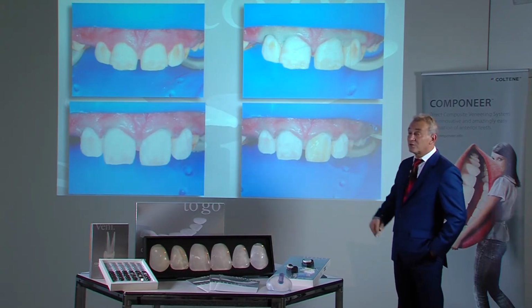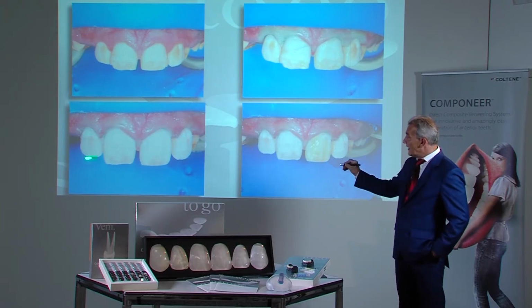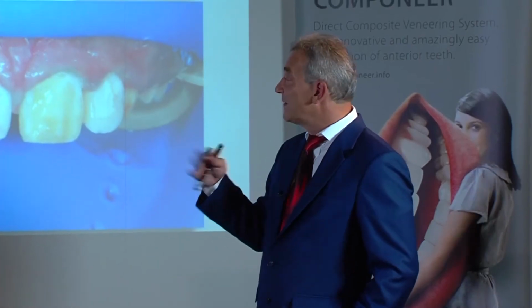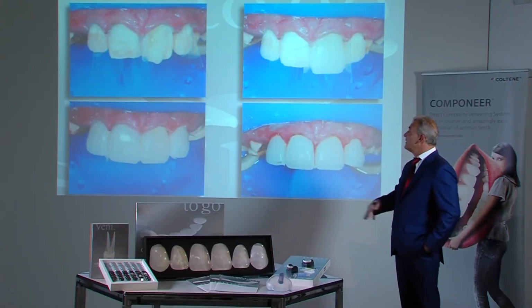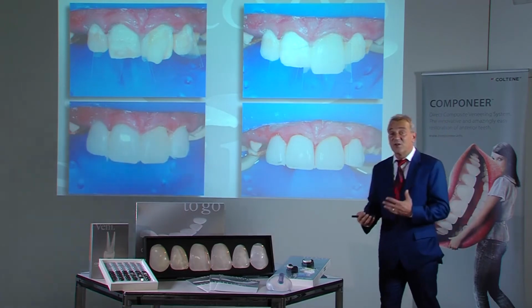Nonetheless, everything was placed under a dental dam. The teeth were prepared slightly on the surface. The enamel is quite porous and crumbly in places, which is why this part was removed. The teeth were etched and bonded, and componeers placed relatively quickly on the surface. This is precisely the situation where Componeer serves us well.